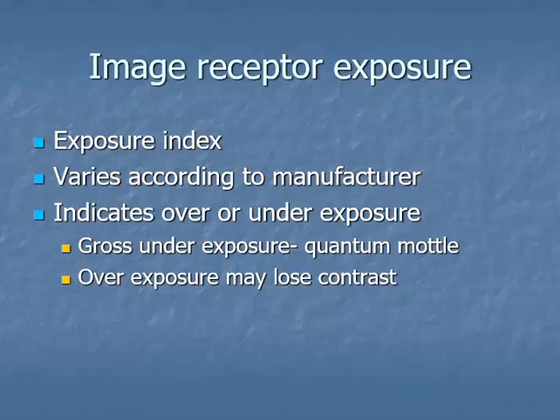Take a look at your index number, take a look at your collimation, take a look at your exposure factors. It has to be a more holistic observation than what it used to be with screens and films. With screens and films, if the image was too light, you needed more radiation. If it was too dark, you needed less radiation. So in image analysis with CR and DR systems, you have to look at more stuff than just how dark the image was.